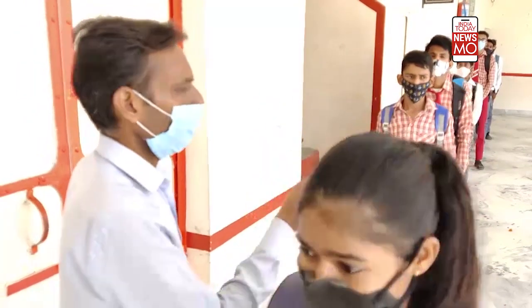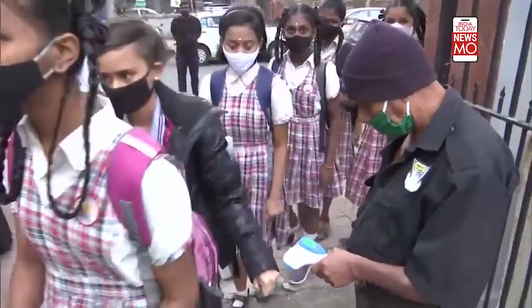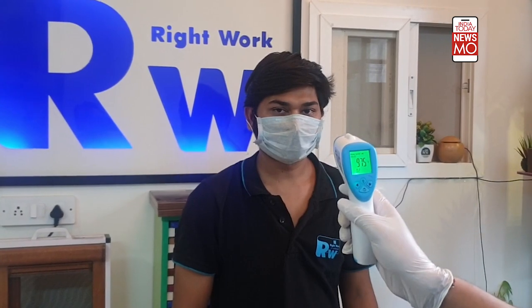As soon as the gun is pointed towards a body, the laser helps pinpoint where it needs to mark the temperature from. Every human body emits a certain amount of thermal radiation. The laser pinpoints towards the human body, then the infrared sensor reads the amount of thermal radiation being emitted. That radiation, through the converging lens, is then read by a thermopile — a device which converts thermal energy into electrical energy — and the temperature is then represented on the digital screen.